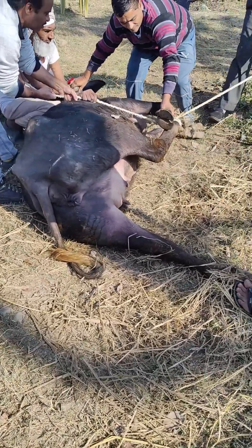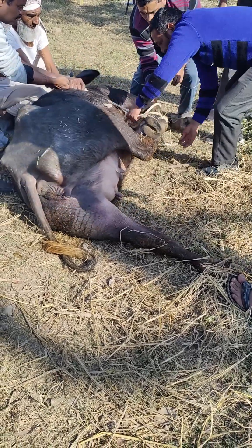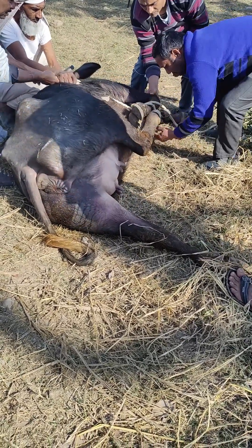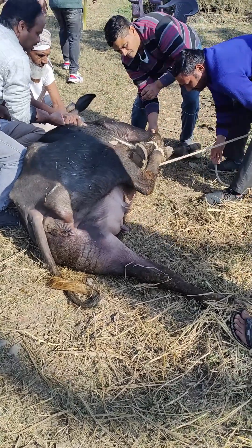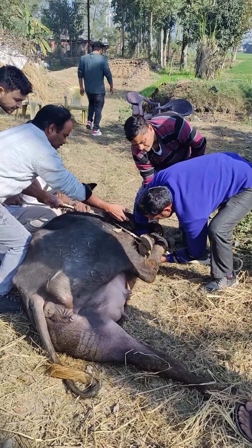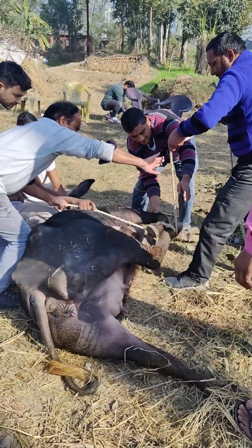For medial patellar desmotomy, the animal was well secured and cast in lateral recumbency. The limbs were extended and restrained by the help of ropes, as you can see in the video.